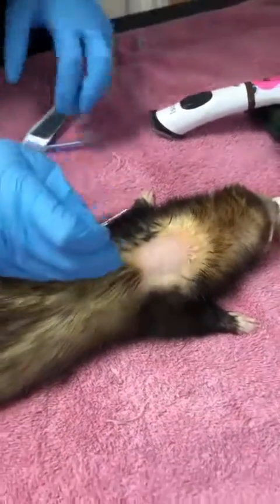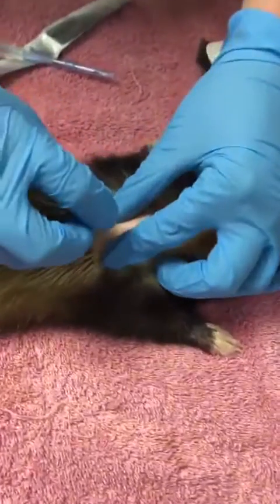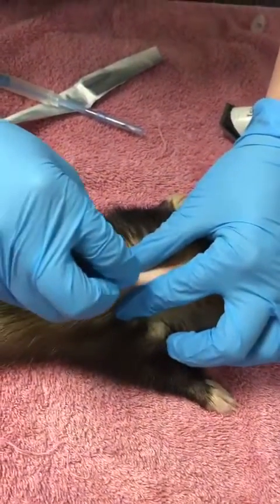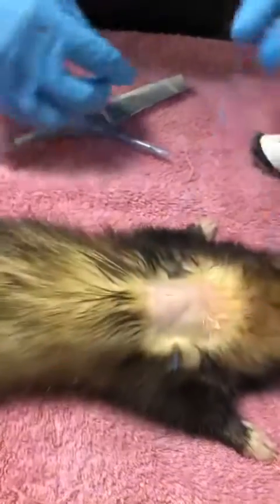Ferrets have a really, really thick skin, so what I normally do is make a tiny incision with a scalpel just in the skin, just to help get the needle through that has the implant in it.